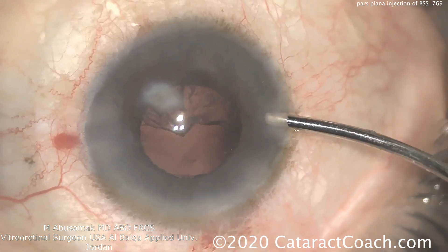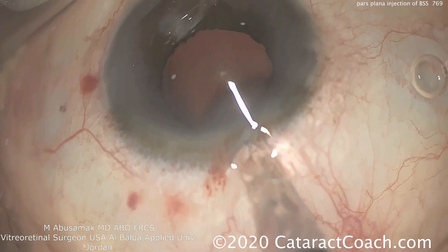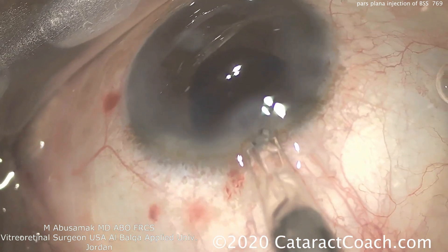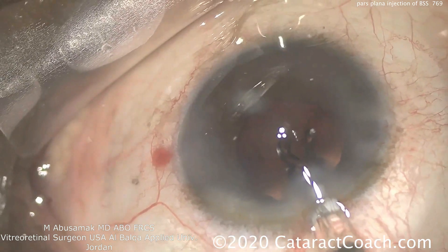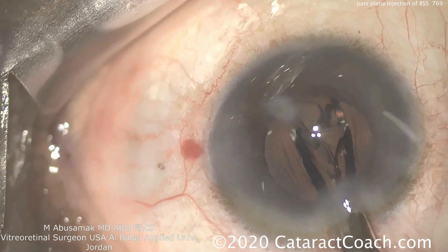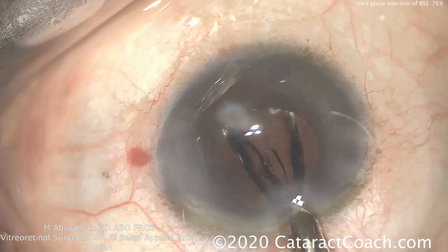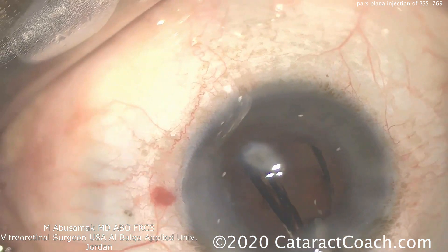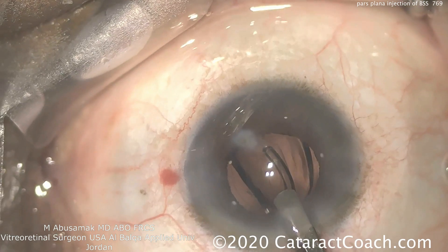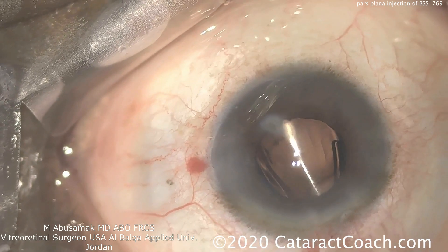Half the cortex is removed, the hand is switched, and the remaining half is taken out as well. Here's the end of the case — the IOL is going in the capsular bag and everything looks great. You should definitely examine the patient's posterior segment in the post-op period. Anytime you place an instrument through the pars plana, make sure there are no entry site breaks. Even a small 30-gauge needle warrants a retinal exam, especially because the patient is very myopic with a long axial length, which carries some additional risk.